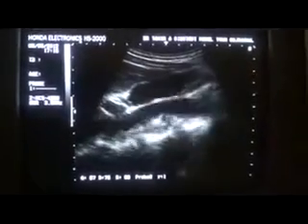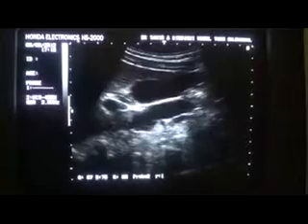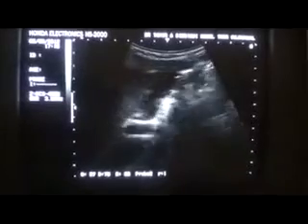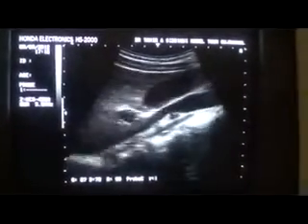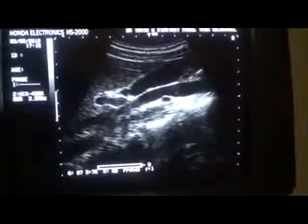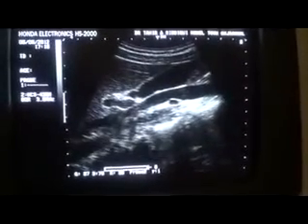So these are the scanning planes for the gallbladder. At times, even if you feel problems, then you may have to ask the patient to stand up and scan so that the viscera come down and you will be able to locate the gallbladder. There is another scanning plane, that is when the patient is in supine posture.